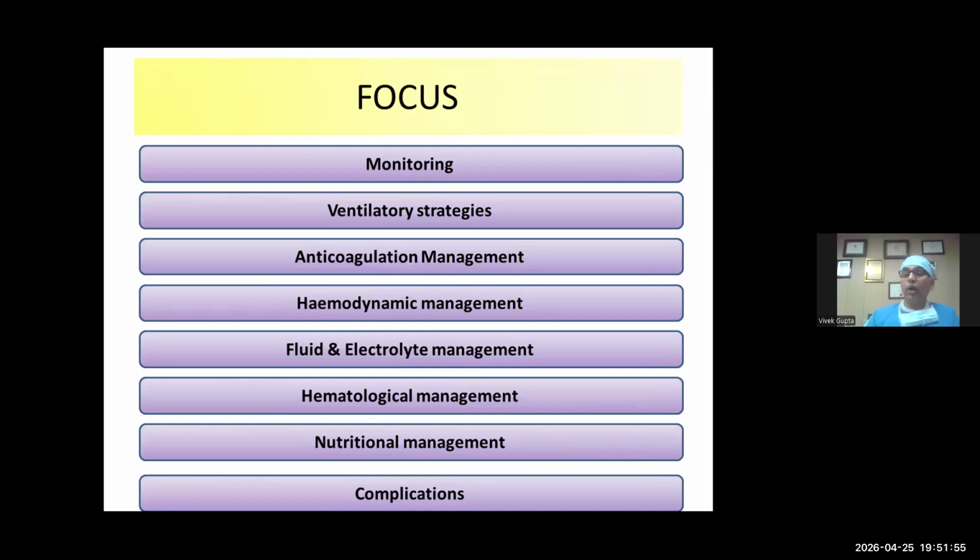So what we do during an ECMO run: we monitor, we maintain the ventilation, we look at anticoagulation management, hemodynamic management, fluid, hematological, and nutritional management, and definitely we monitor these patients to prevent complications.